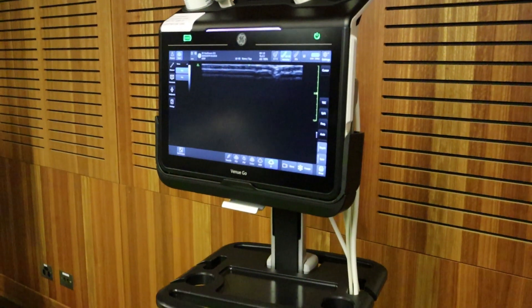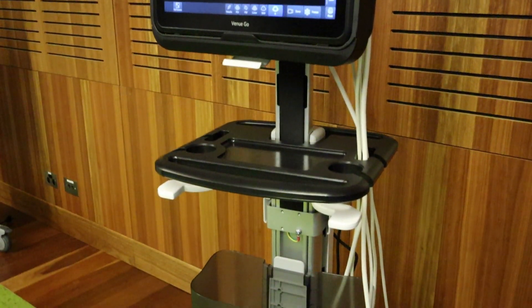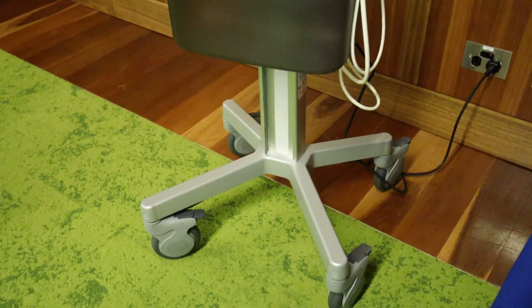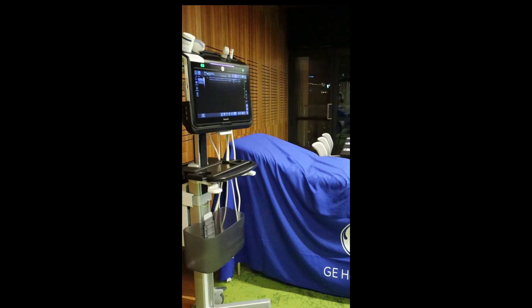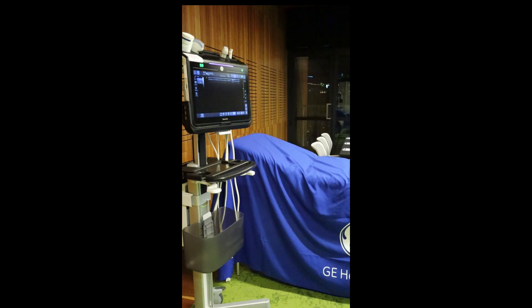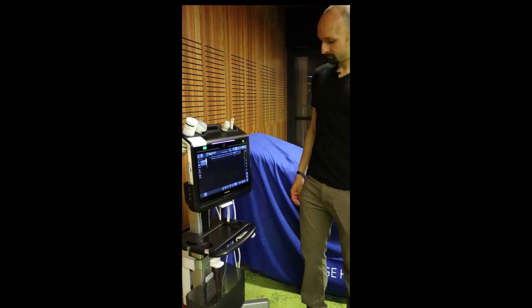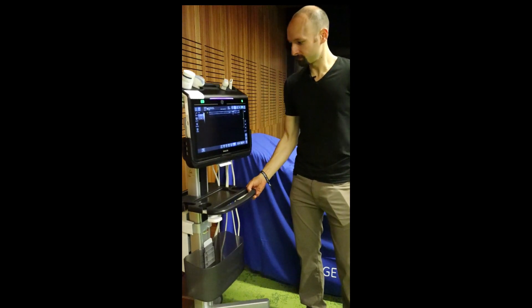Here is my first look at this GE Venue Go. Pretty slick machine — it's got a very similar setup as the regular Venue. I really like the portability of this thing. You can just click this little button, bring it all the way down, bring it all the way up. It's got a pretty sweet cart here that is versatile.